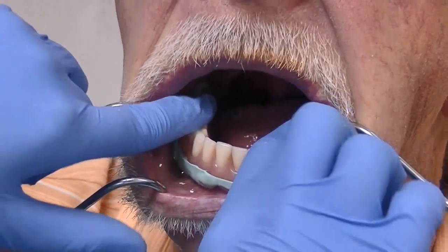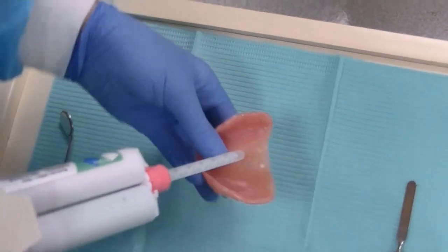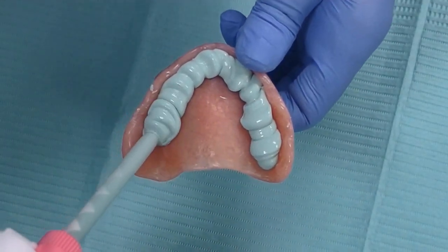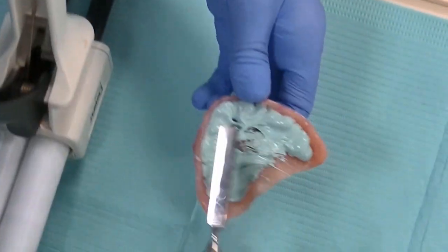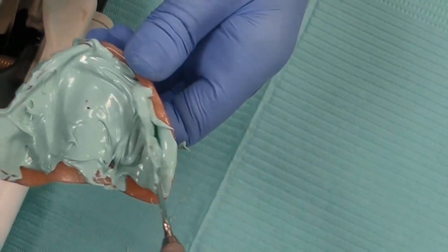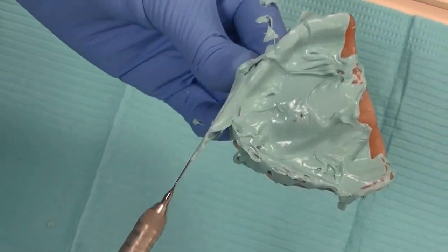As we seat that back into the mouth, we verify that everything has been done correctly. We're going to repeat this procedure as a clinical demonstration for the maxillary arch as well. We seat the mandibular arch and repeat the procedure for the maxillary arch, injecting onto a dried intaglio surface and using a spatula to move the impression material around, verifying that we have an equal distribution of our radiopaque PVS material everywhere around the maxillary arch.